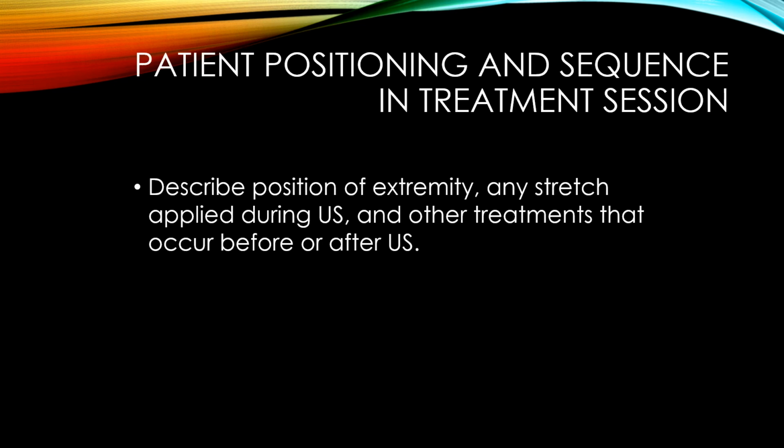Another thing that's important to document when you're doing therapeutic ultrasound is the patient positioning and also the sequence of the treatment session. So you want to describe the positioning of the extremity while the ultrasound was being applied, including any stretch that may have been applied while you were applying the ultrasound, and then any other treatments that occur either before or after the ultrasound, as sequence can have a big influence on the overall effect as well.